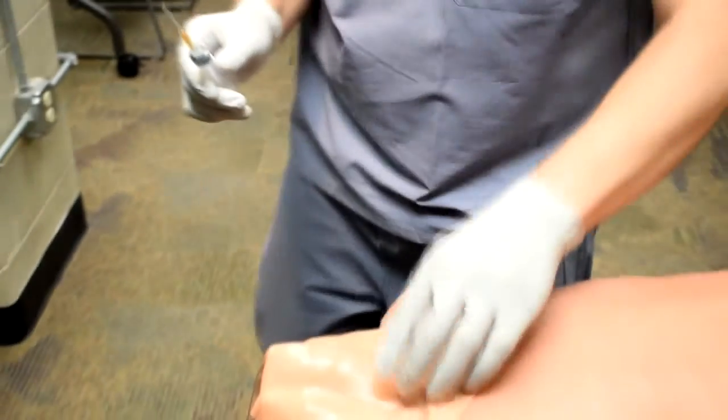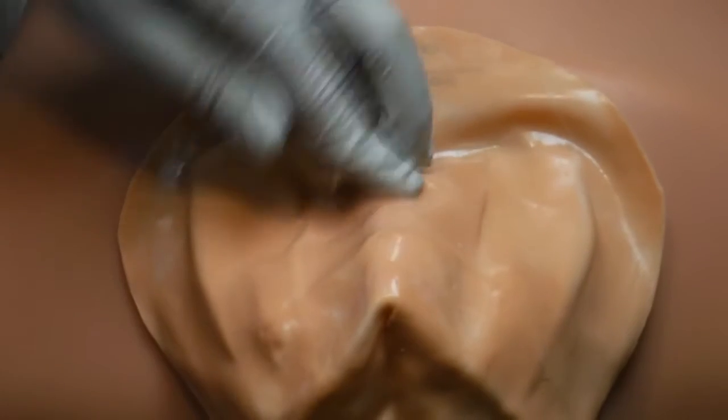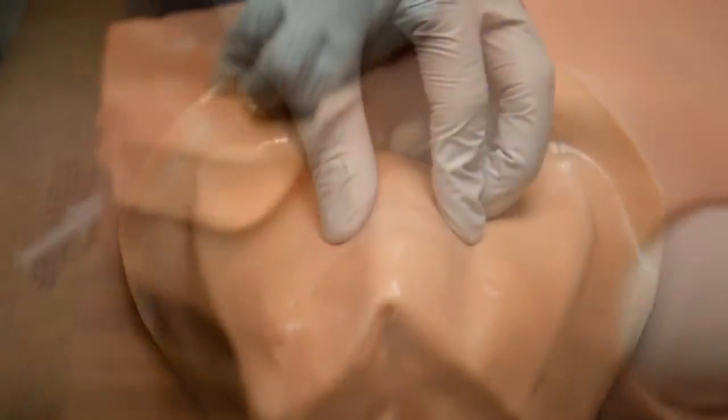I approach the patient and use my left hand to feel the anatomy: sternal notch, trachea, cricoid cartilage, divot, thyroid cartilage — and stabilize the airway.